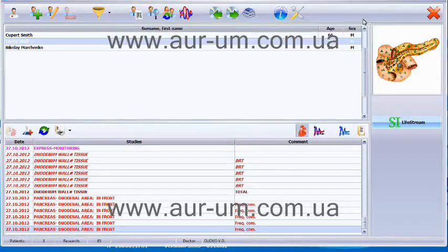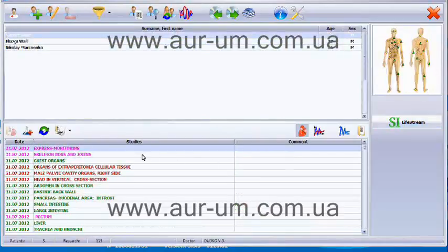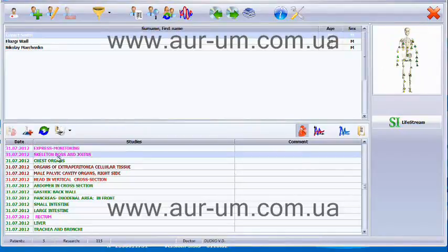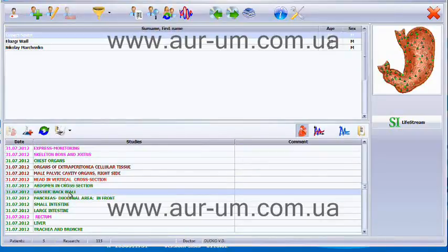This would be all about the main characteristics of this software and device. So we started with testing organs, we analyzed the problems. After you already have an idea of the analysis, when you analyzed all the steps starting from express monitoring, the whole body, going through the systems, and then going through every organ that you have chosen, you bring all the information into conclusion. Based on that information, you can treat the patient.